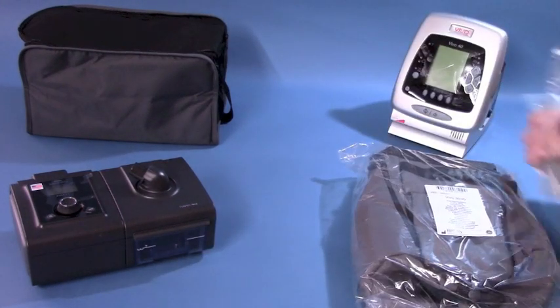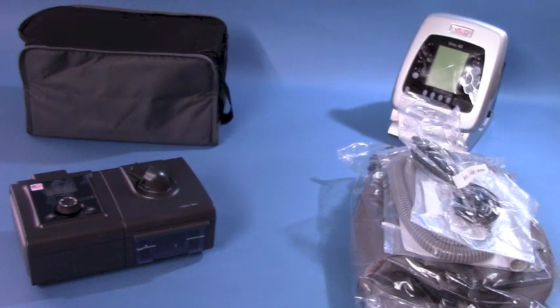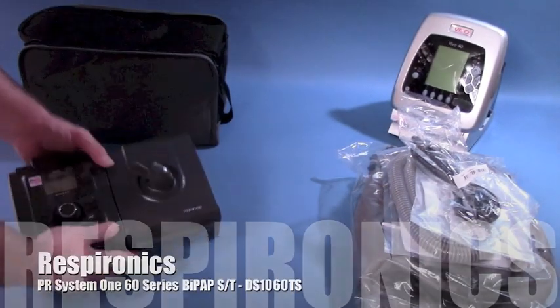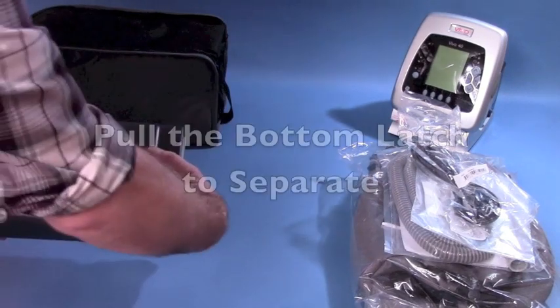These are typical supplies included with most CPAP machines, and you will find the same inside the BiPAP machine we will now cover, which is the Respironics PR System 1 DS-1060.